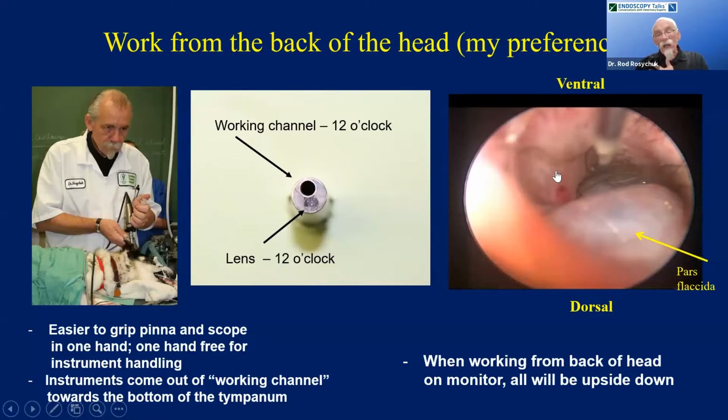So it's a natural way of protecting myself as I come out in the ear. And to be very honest with you, I think this also allows me to hold the scope and pin in one hand if I happen to be doing procedures by myself, and it also seems to give me a better view of the tympanum.